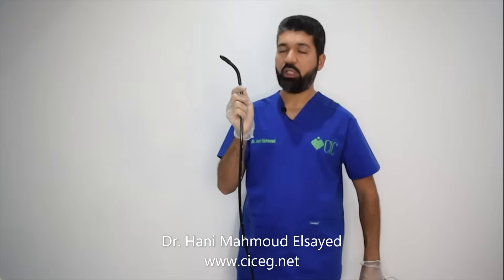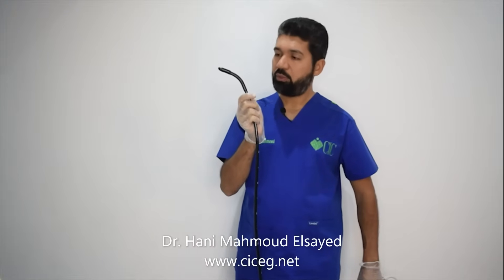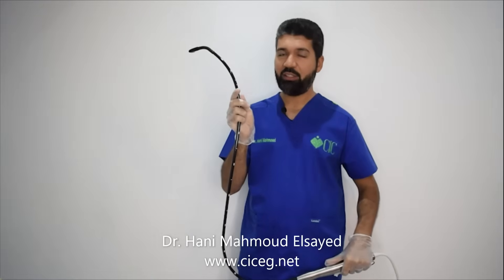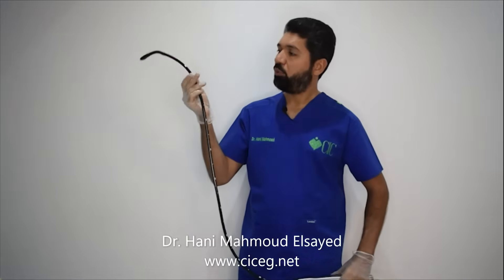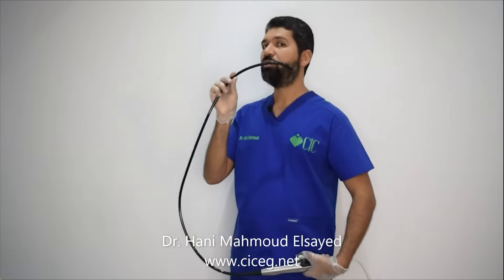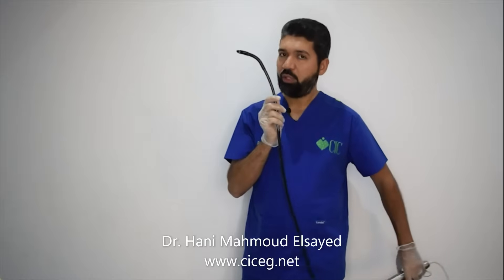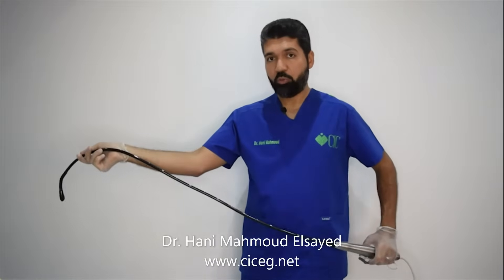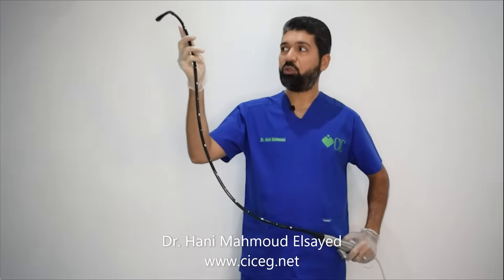I usually advise not to hold the probe very proximally during intubation, because if this part enters the mouth, you have to release the probe and catch it elsewhere, and the probe may rotate. It is much better to hold it from about 25 centimeters, or at least 20, and then introduce the probe. This way you don't have to release and re-grip. Hold it from a distance of about 20 cm, make your curve, and introduce the probe until the patient swallows, without releasing the probe — you pass the cricopharyngeus and then you are safe to advance further.